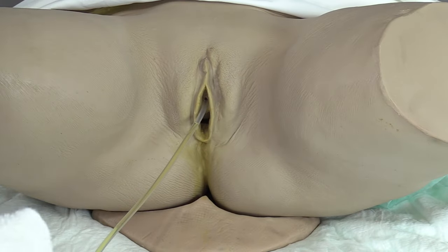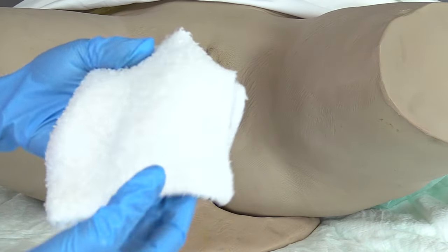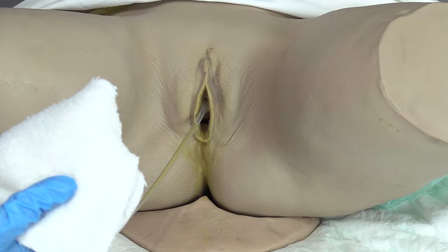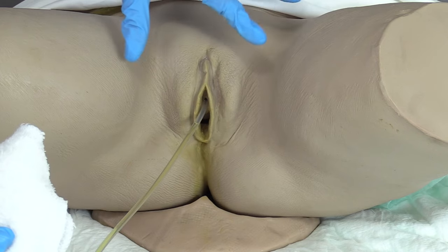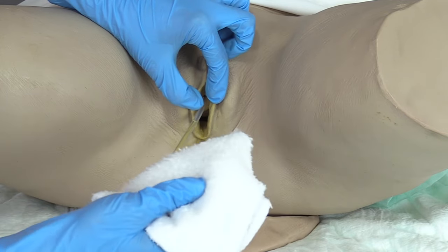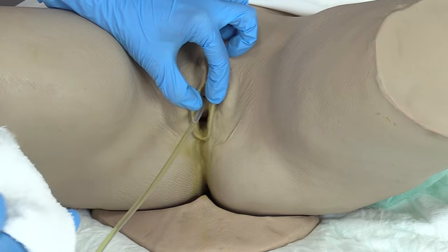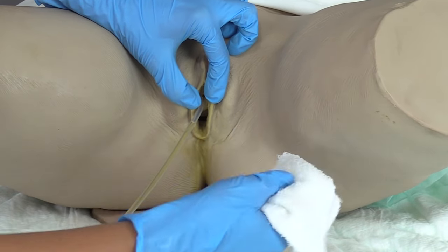And then lastly, we're going to clean the labia minora and the urinary meatus. So I've got a clean cloth with soap and water on it, and I've leafed it. We're going to start with the labia furthest away. So warn the patient that you're going to be spreading the labia minora. Now the thing here with this mannequin, the tissues are very stiff. In a real person, they are very easy to spread, and you can really get in there. You can get around the urinary meatus and get each fold of the labia. Here, the mannequin does not want to cooperate, so you will get the idea.